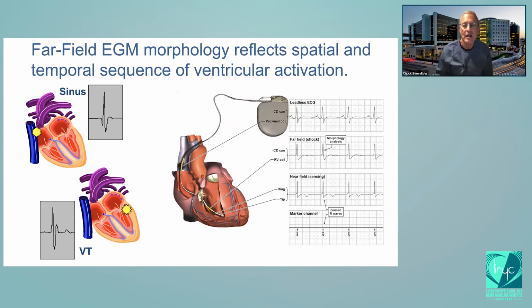And the key idea is we can use far field shock electrograms or the surface ECG to make morphology decisions, right? Don't use the local sensing electrogram, which is great for timing, but not good for morphology.